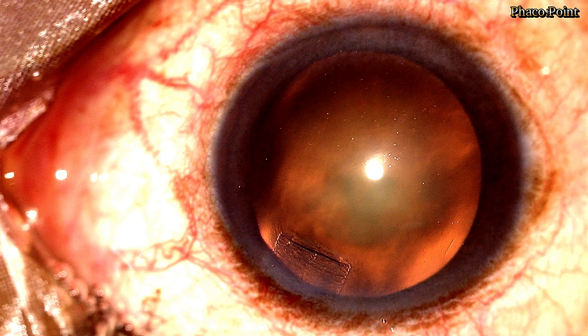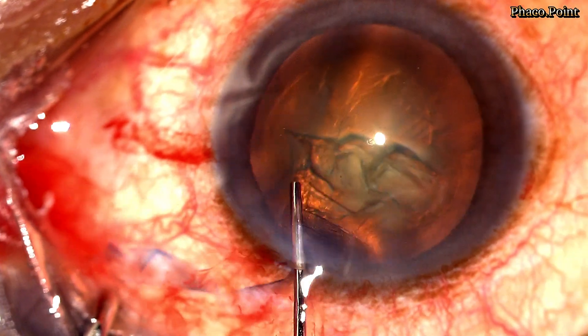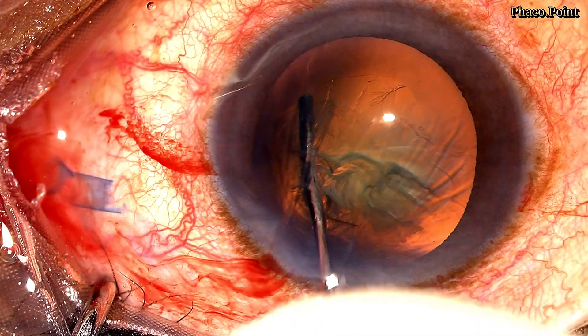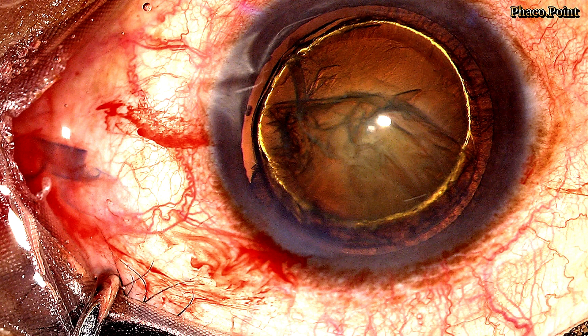Here's a patient with a posterior polar cataract with a very early nucleus sclerosis. Prior to performing the hydrodelineation, I decompress the anterior chamber by pressing on the posterior lip. After which, the hydrocannula is introduced well into the substance of this rather soft cataract and a wave of fluid injected. This results in a successful hydrodelineation, evident here by the appearance of the golden ring.